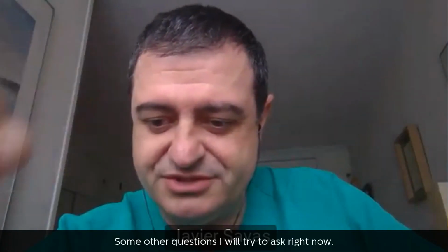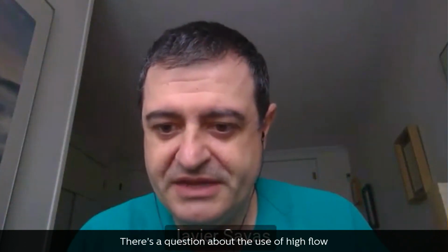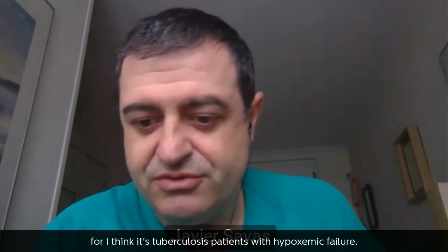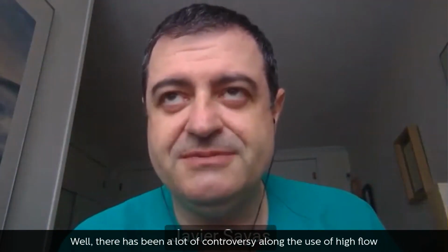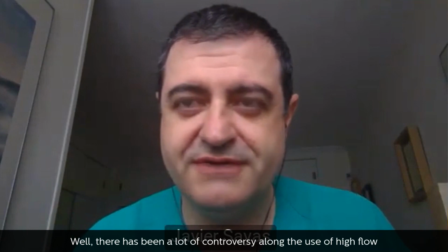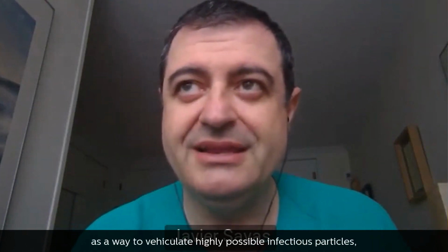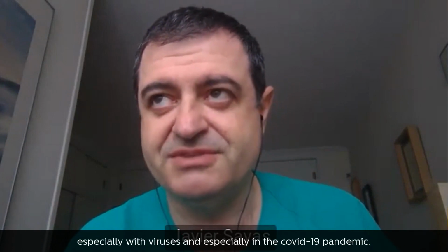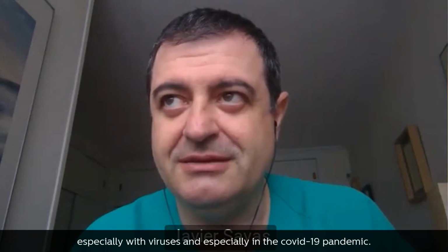Some other questions I will try to ask right now. There's a question about the use of high flow for, I think, tuberculosis patients with hypoxemic failure. Well, there has been a lot of controversy on the use of high flow as a way to convey potentially infectious particles, especially viruses, and especially in the COVID-19 pandemic.